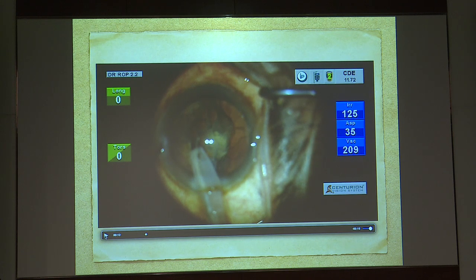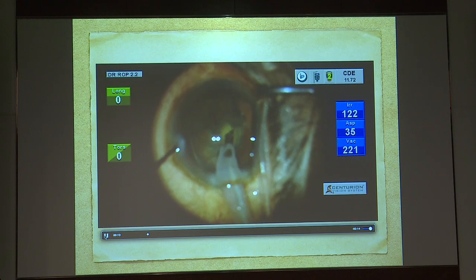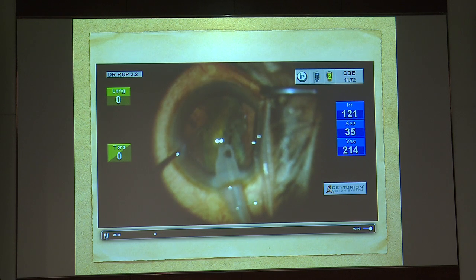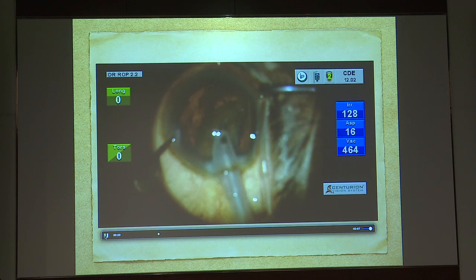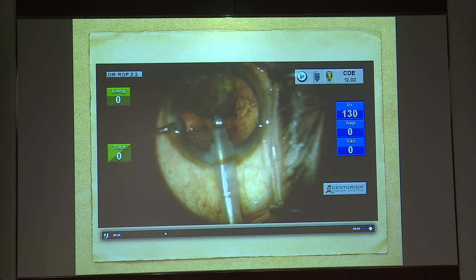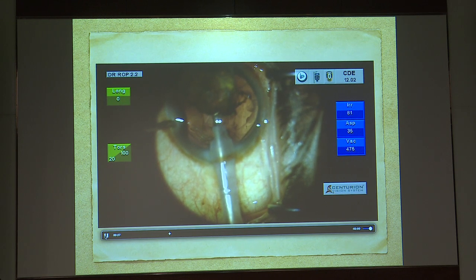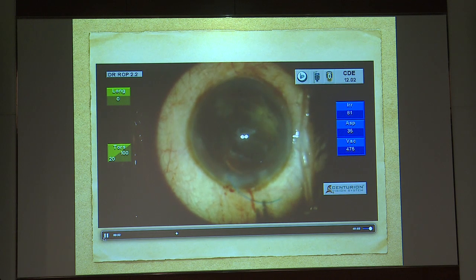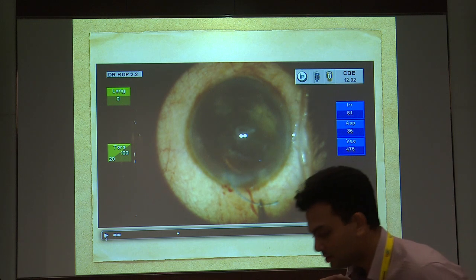So what should we do? The golden rule is just to stay calm and don't withdraw the phacoprobe from the eye. Just slightly manipulate. I have tried to manipulate the nucleus slightly at a superior plane, and without removing the phacoprobe out first, through the side port, we have injected viscoelastic substance so that the AC does not collapse. Now, if we want to phacoemulsify the remaining heminucleus, what can be done?